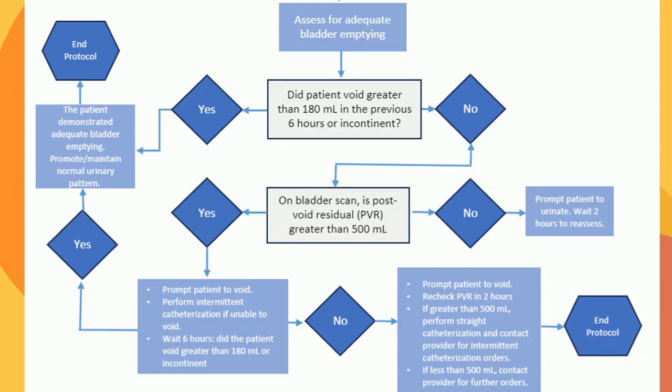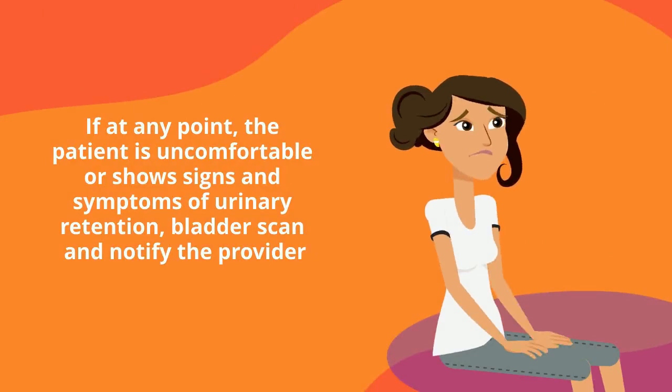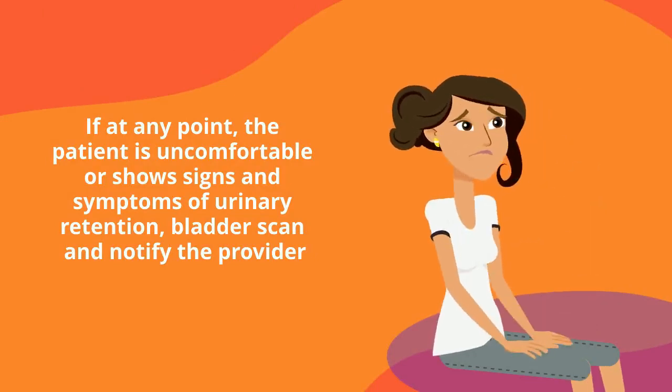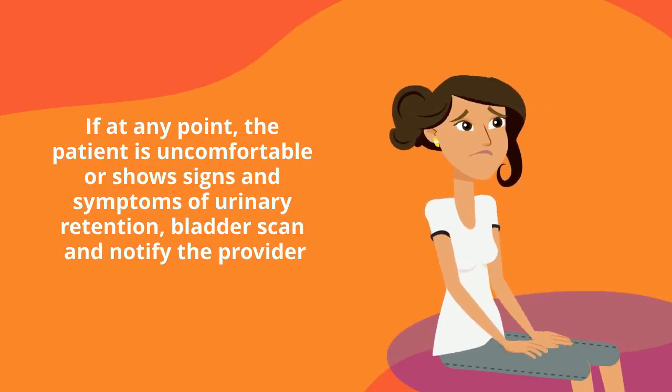On the bladder scan, if the post-void residual is not greater than 500 mLs, then you want to prompt the patient to urinate and wait 2 hours to reassess. If at any point during the protocol the patient is uncomfortable or shows signs and symptoms of urinary retention, bladder scan the patient and notify the provider.